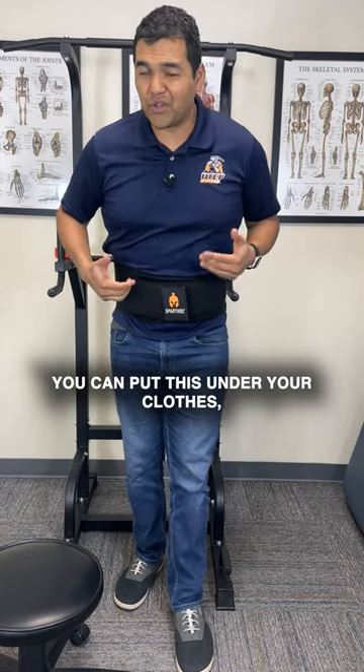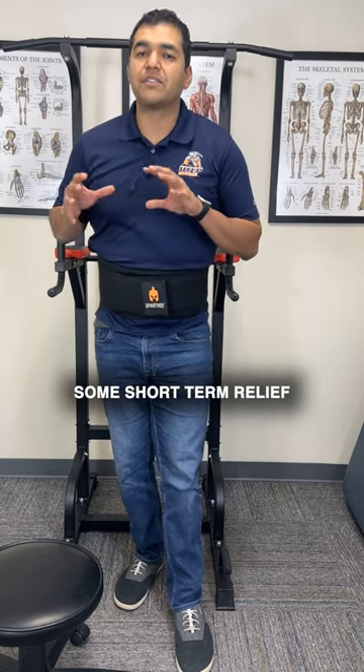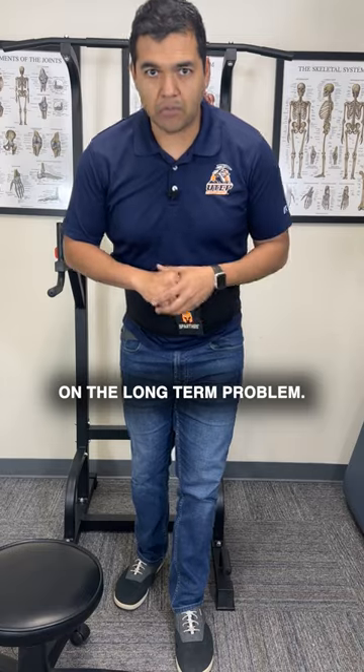You can put this under your clothes or over your clothes. The point is not to rely on this for the long term, but for it to give you some short-term relief so that you can begin to work on the long-term problem.